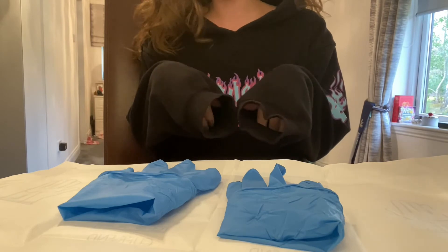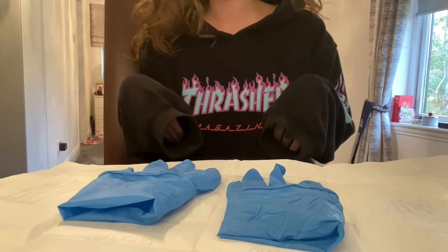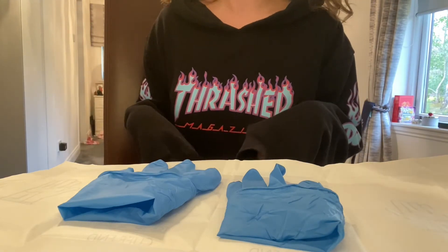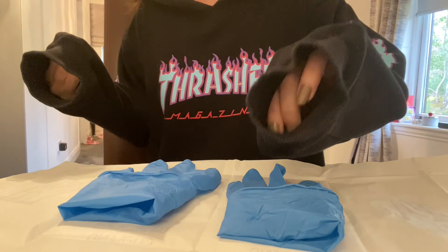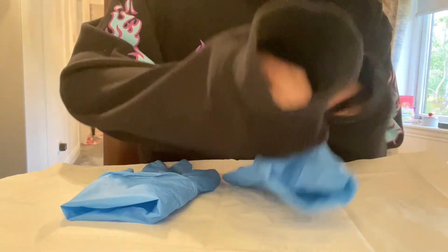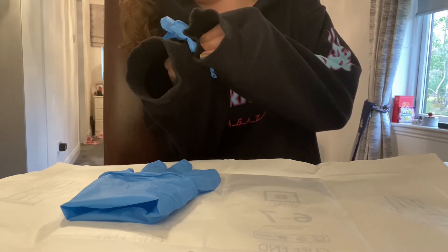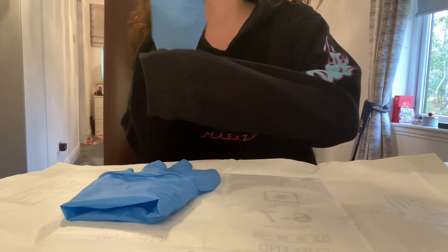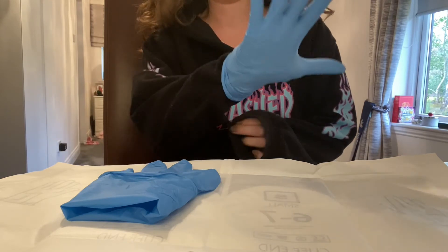I've got my packet here and I've opened them out. This time the fingers are facing towards me, not away from me like in the open technique. I'm going to put the right glove on first, which in this case is along my left side. I place my left hand on top of the fingers to grab the cuff of the right glove, flip it up and lay it flat, then pinch the cuff and pull it over in one sweeping motion. That glove is on.